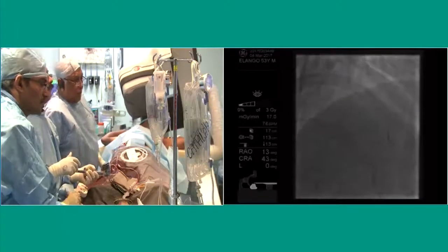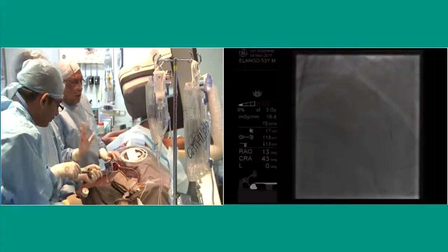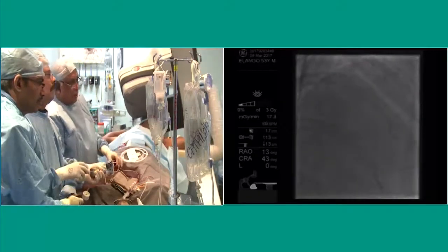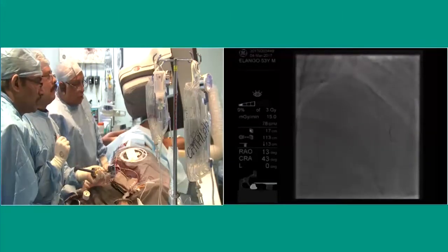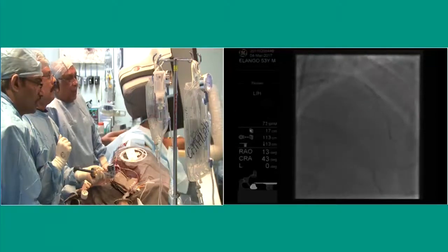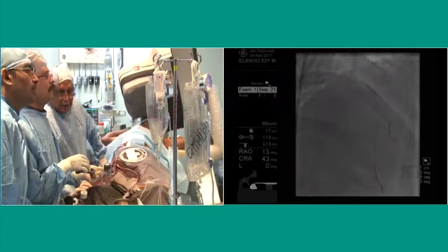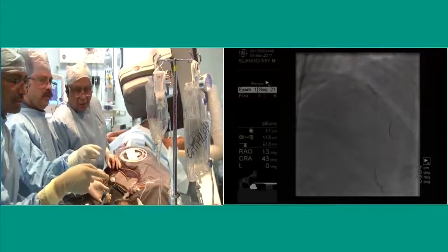Now the question is, I'm going to dilate the diagonal ostium and the stent. Negative. And you're going to do a kissing. Okay, go up. Whether I would do a kissing before the stent or not, I will not. Well, you can always POT it. I would like the stent to be a little deformed like this. I can always POT it. My balloon is across. I will deliver the stent, and then you can POT. Do the final kissing. That's right. Yeah. Give me the 15.